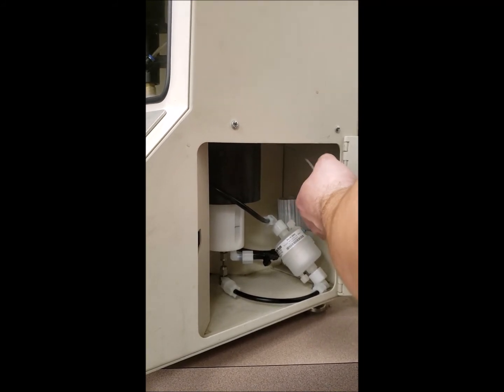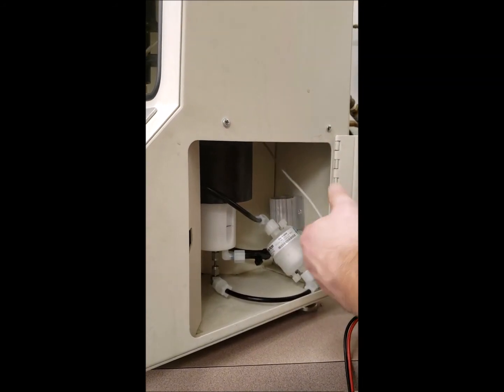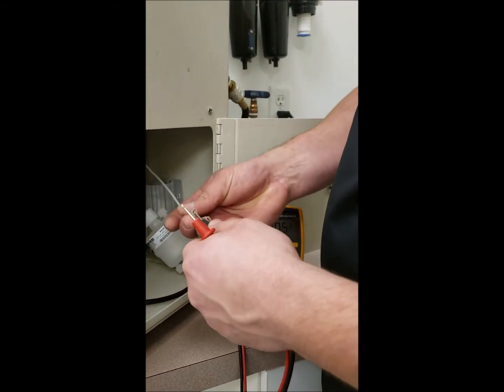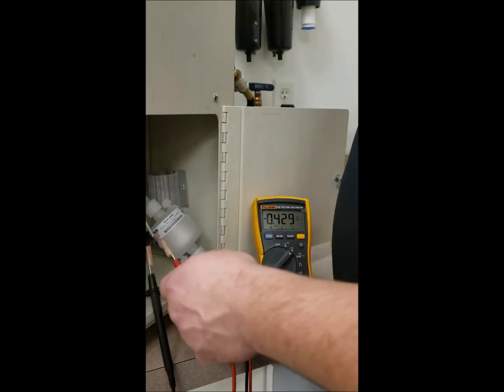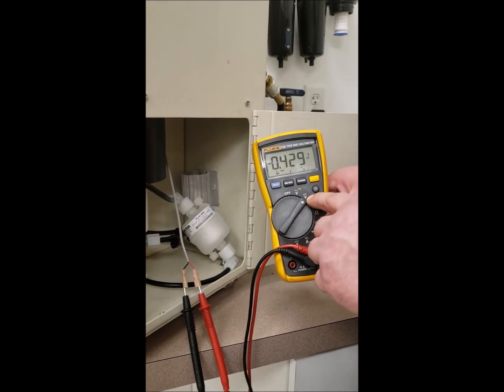You're going to take a multimeter. You'll put your black probe into the black terminal connector and the red probe into the red terminal connector. You're going to set your multimeter to DC voltage.